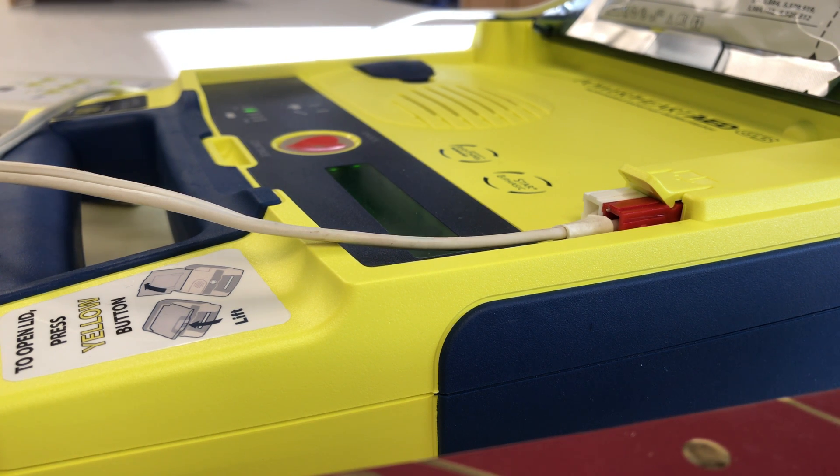Do not touch. Preparing shock. Move away from the patient. Press the red flashing button to deliver shock. Shock delivered.